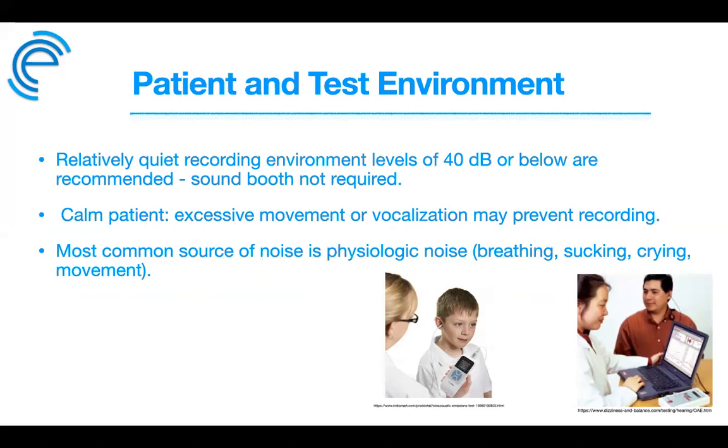You want the patient to be calm, with no excessive movement and no speaking during the test. Ideally, for newborns, it would be better if the test was done after they eat or right before nap time, so they can be sleeping. With older patients, they can sit on their parents' lap. They can watch a short animation or hold a toy to distract them.